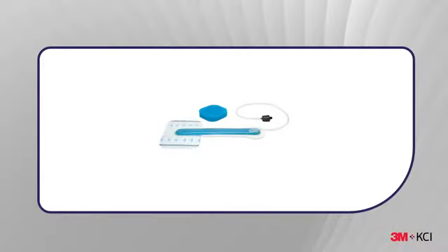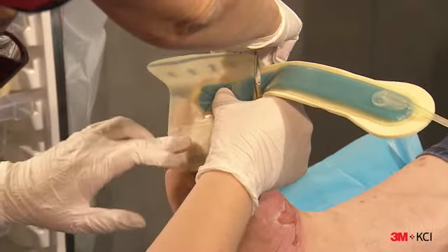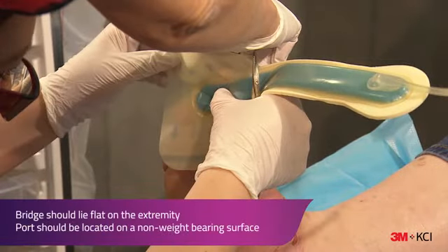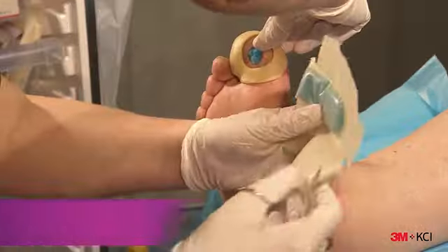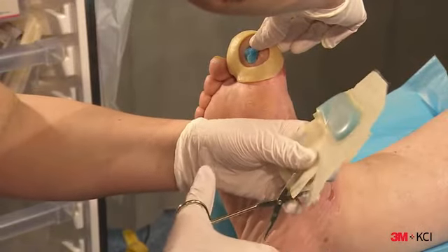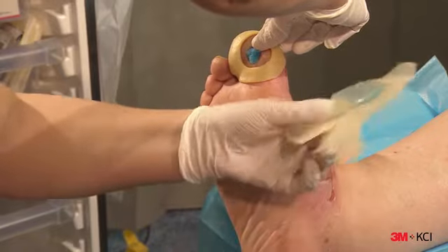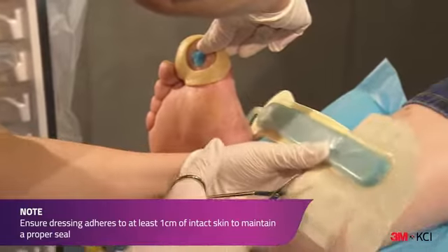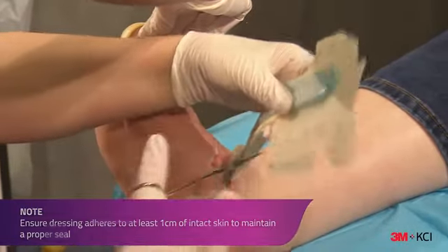The Snap Bridge Dressing is used to minimise the chance of additional pressure points. The best orientation of the dressing is determined so that the bridge portion of the dressing will lie flat on the extremity and the port is located on a non-weight-bearing surface. Prior to application, the bridge dressing can be trimmed and shaped to size to suit patient requirements. The dressing should be adhered to at least one centimetre of intact skin to maintain a proper seal.